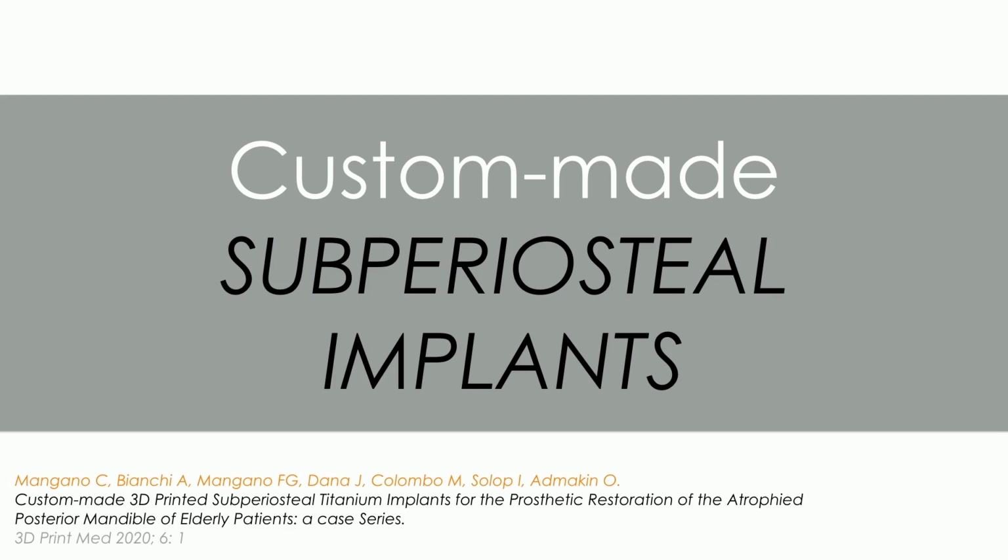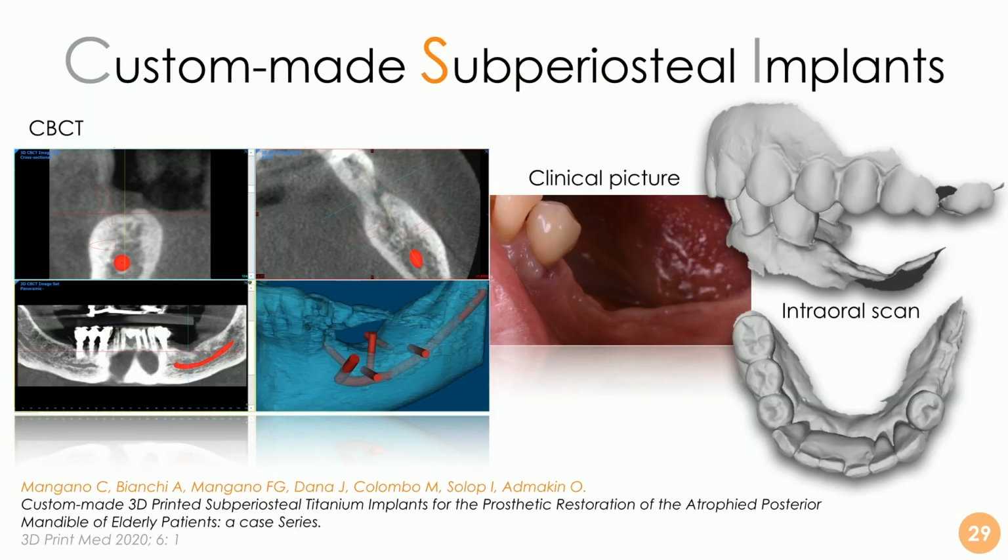This is a good application. For example, we have seen elderly patients who already underwent some bone regeneration techniques or therapies that failed. And these people don't want to undergo again a long treatment like regenerative bone surgery to augment the bone volume. They only want to replace their teeth that have been lost. And in this case, we can design a custom-made subperiosteal implant in order to satisfy the request of the patient without spending too much time and money. And it's an interesting option.